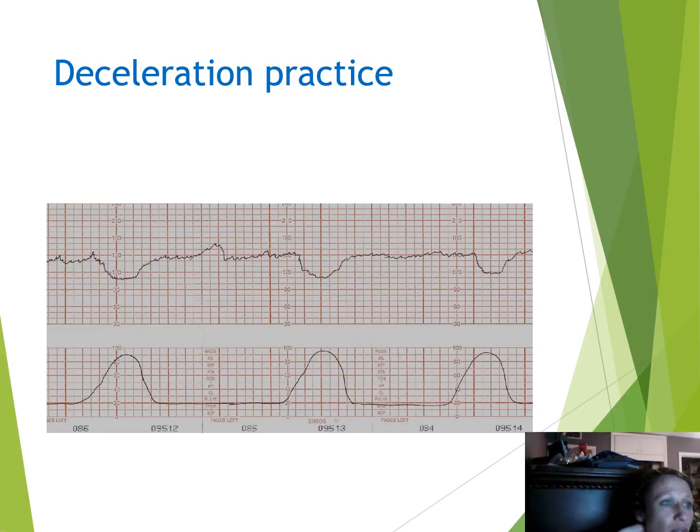And then for our decelerations, the nadir of our decel matches up to the peak of the contraction. So these are early decelerations. You see that?